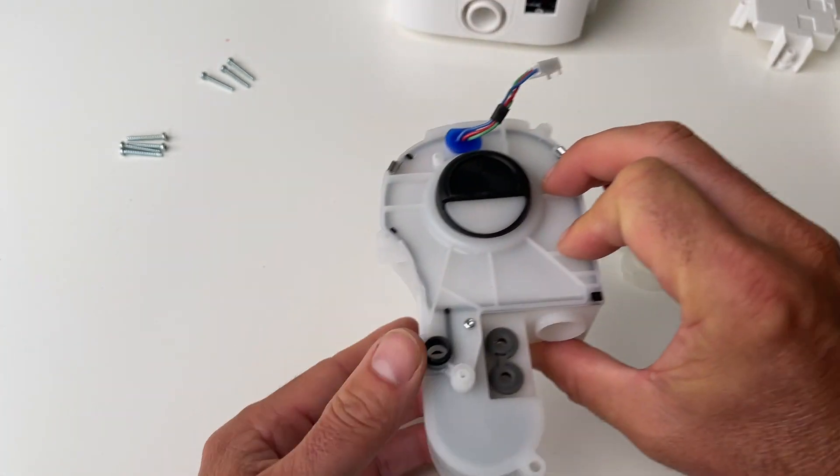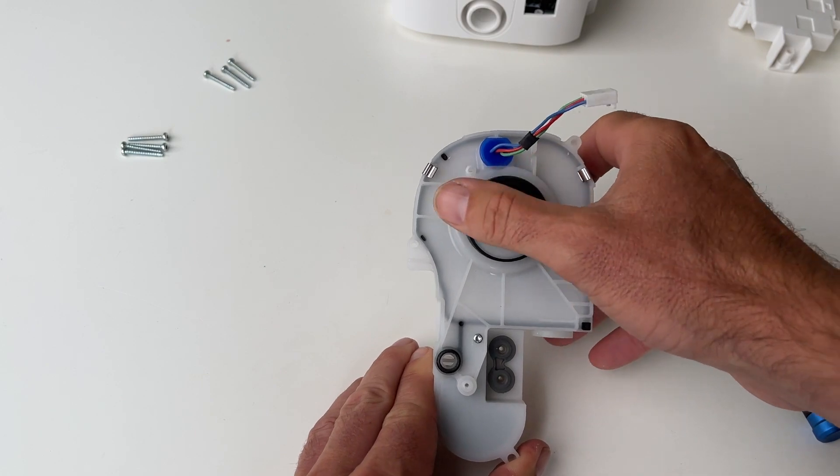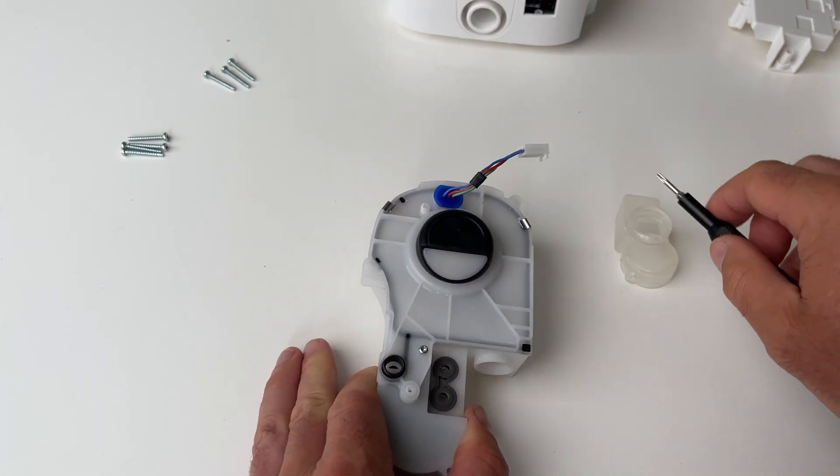Here's our turbine casing — the little turbine sits inside here. If you take that little screw out, I might as well just show you.